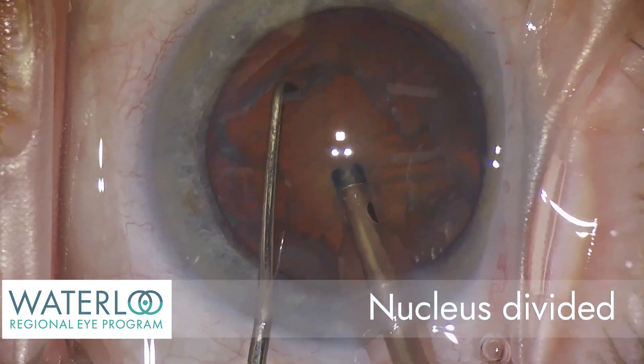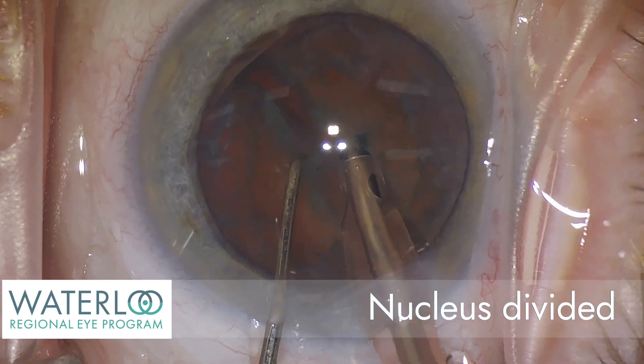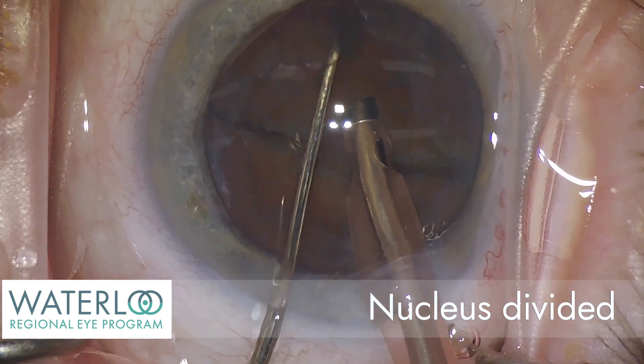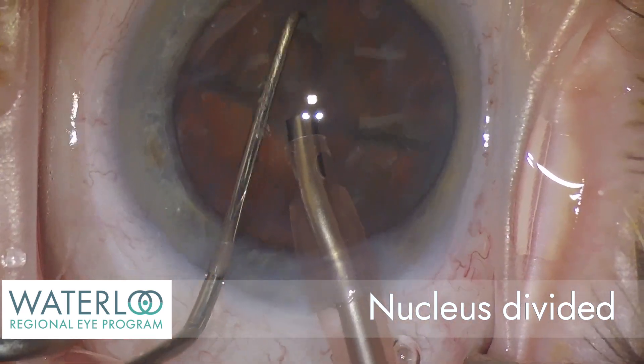The nucleus, the central part of the cataract, is first divided into two. The cataract is then rotated and divided into smaller fragments.